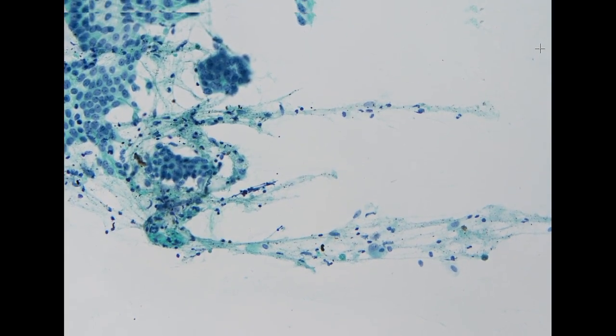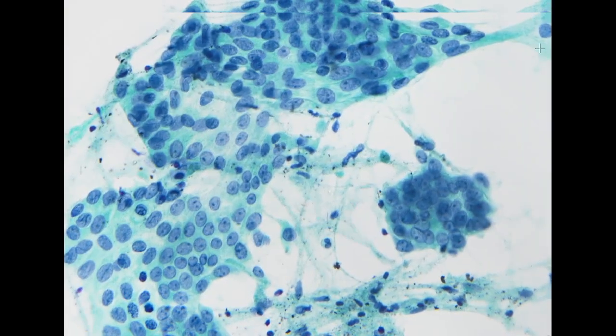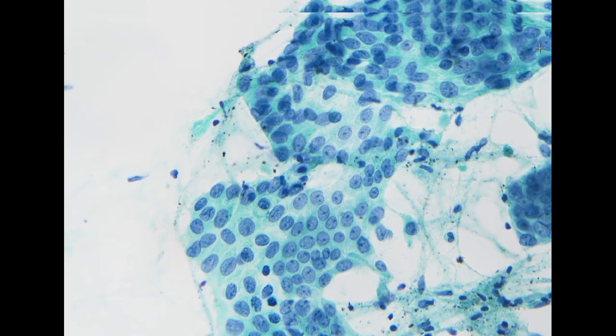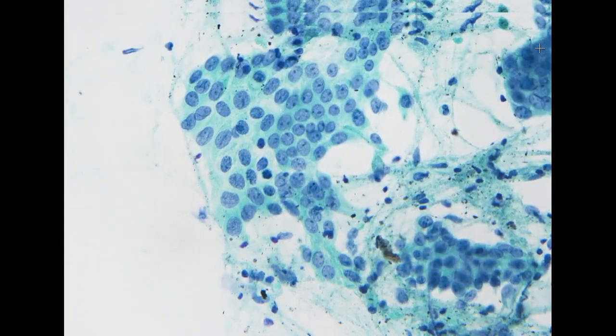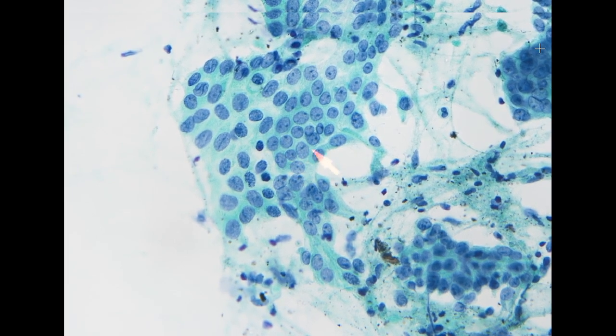So I think for this case, we do have a lot of areas suspicious for well-differentiated adenocarcinoma, such as this one. Again, we can appreciate what we call the drunken honeycombing, which means that the distance between the nuclei is a little bit uneven. Some are tighter, some are more distant.